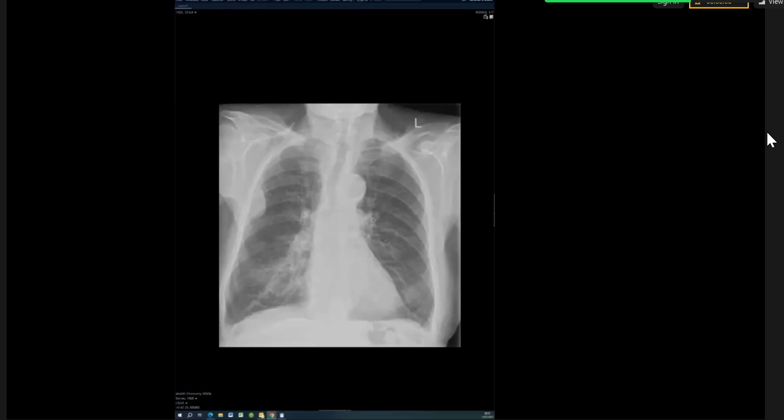Collapse doesn't always mean there is something wrong with that part of the lung. Collapse can be secondary to something proximal to the lung. Collapse just means that part of the lung deflated. So collapse has to cause volume loss. That part of the lung has to get smaller. Consolidation alone is replacement of the air spaces with something else. It could be blood, pus, water, inhaling something, or a reaction, exudative collection inside the air spaces. So consolidation means normal lung volume air is replaced by something else.